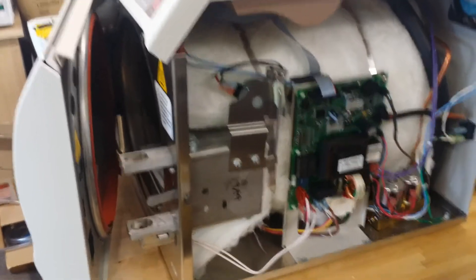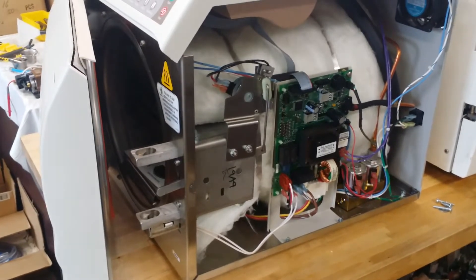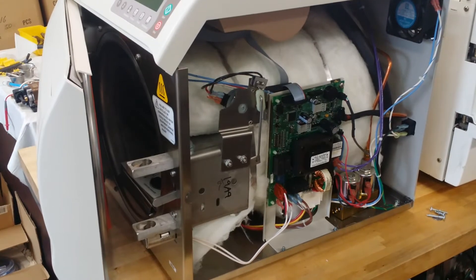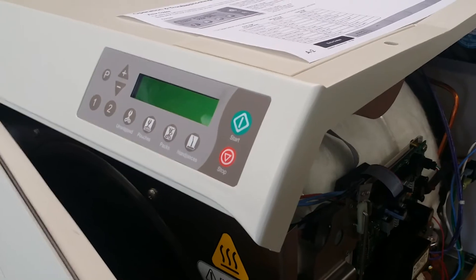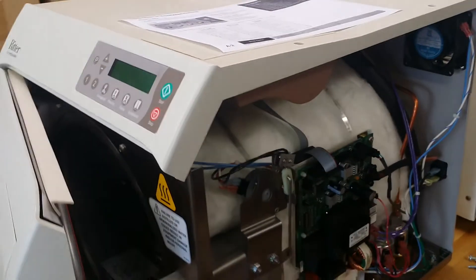So those three-digit error codes are very, very important to tell you where the problem is and how to fix it. Make sure to write down the error code if any problem happens. Write down the error code and give it to us — we are happy to fix the problem.